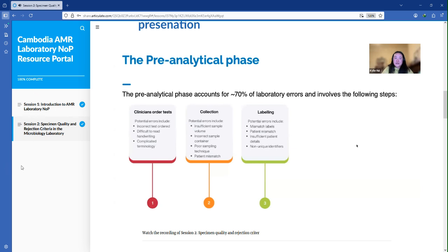The second one is urine quality. The quality of urine collection directly impacts the end culture result. To ensure laboratories receive quality samples, collection centres should ensure there are clear instructions for patients so that they know what to expect when they're collecting the urine sample. Cleaning materials, such as wet wipes, would ideally be provided for the patient's clean area before collection.